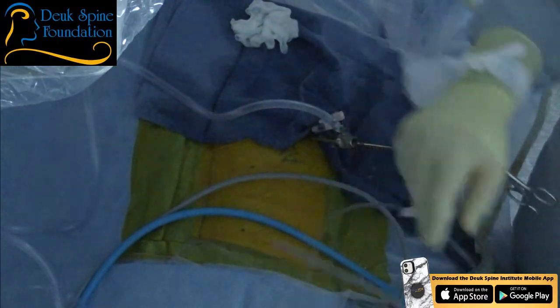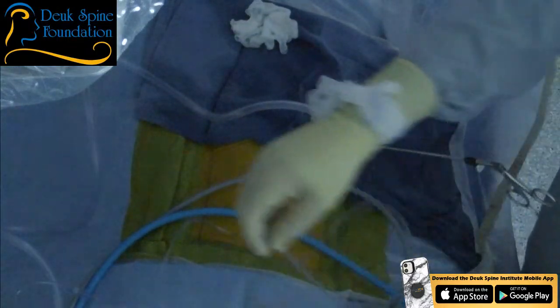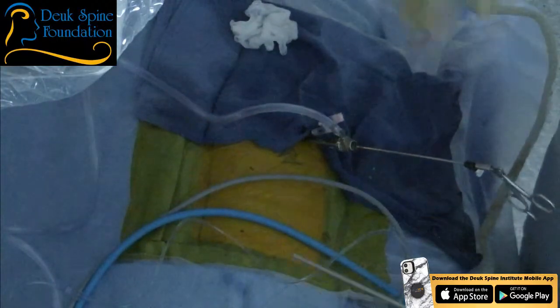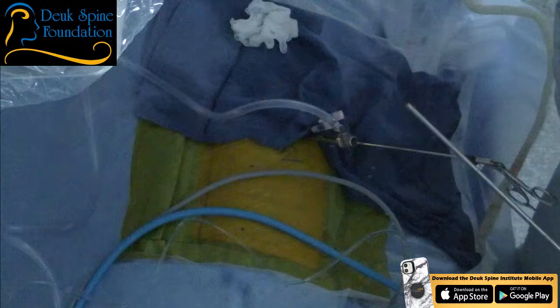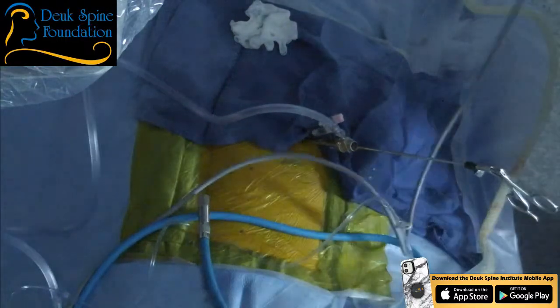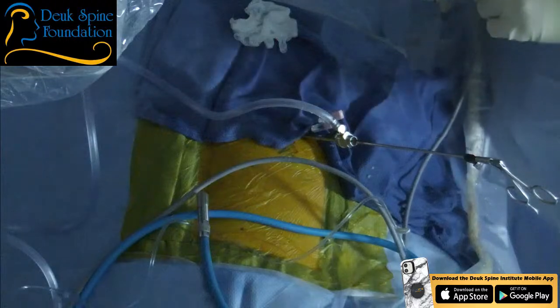It's not for the bleeding. We're going to change the scope. The scope itself looks like it could be that one of the lenses has shifted, which sucks because A, we have to get another one, but B, these scopes are very expensive to repair.